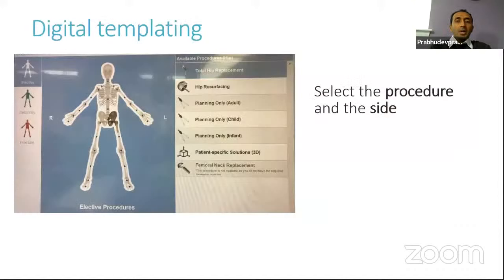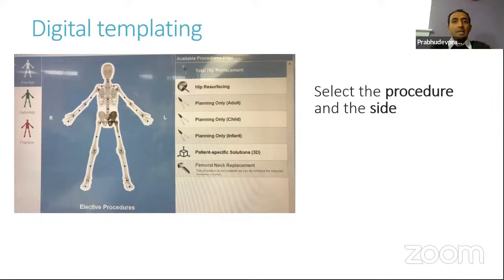You can do either conventional or digital templating — in the present day, digital templating is pretty much the standard and makes the process much easier with different software available. This is the software I use in my practice. When you do digital templating, you upload the X-rays to the software, which takes you to a page where you select the procedure you're doing and also the side — it's important to select the side.